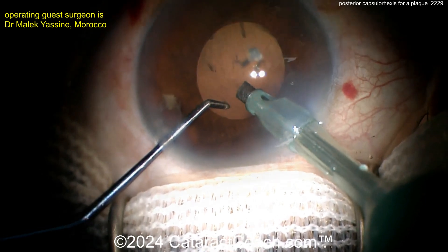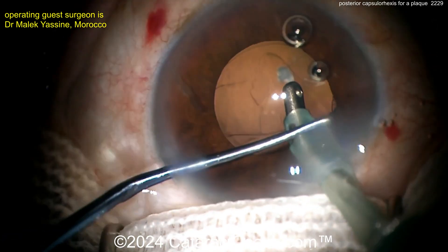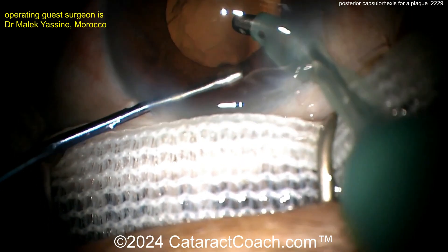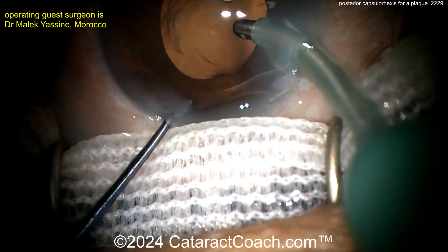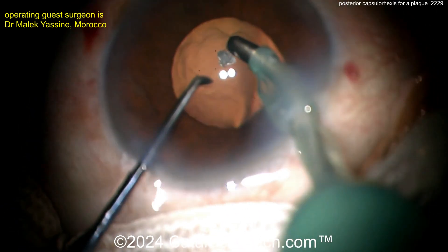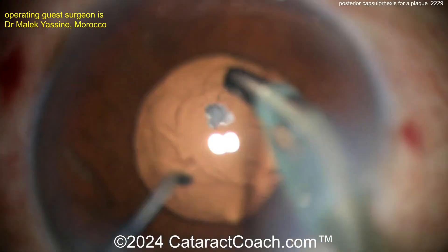There's that plaque on the posterior capsule. What are your options here? You can try to get that plaque up. I like this technique — using the chopper in one hand and the I/A probe on the other to look under the iris and make sure you get all the cortex out. That's a nice technique, I do that myself. Now trying to get this plaque off.